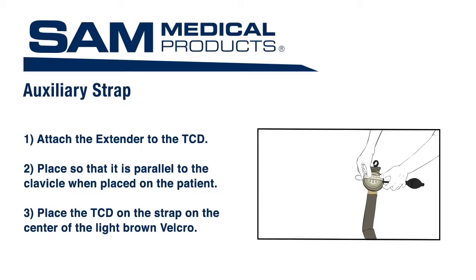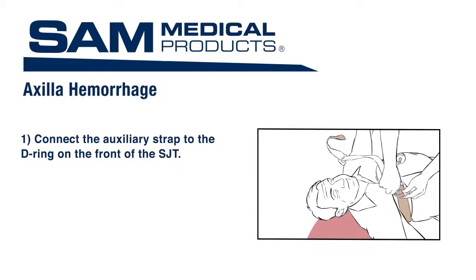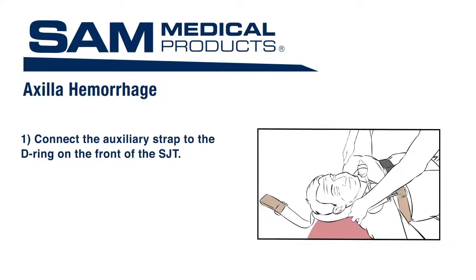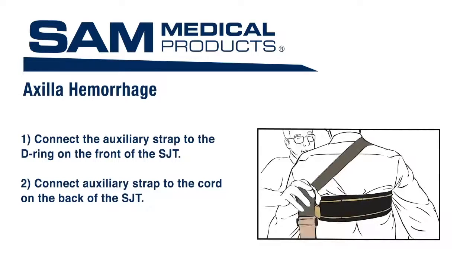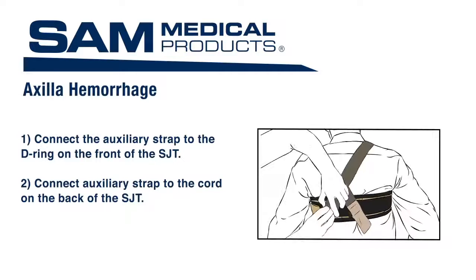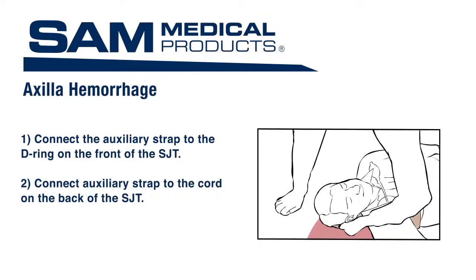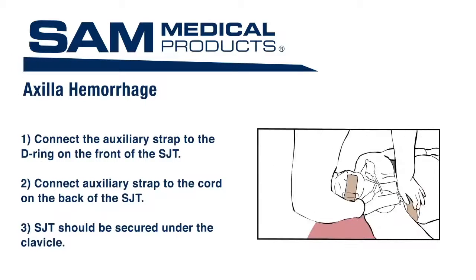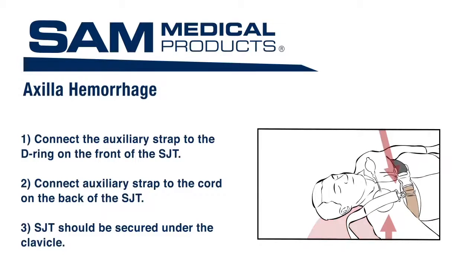The extender should be placed so that it is parallel to the clavicle when placed on the patient and should align with the tube. Then place the TCD on the strap on the center of the light brown Velcro with the tube and hand pump extending out. Connect the auxiliary strap to the D-ring on the front of the SJT using the large clip. Connect the other end of the auxiliary strap to the cord on the back of the SJT using the small clip, as close as possible to the patient's midline. Remove any slack by securely tightening the strap using the brown handle. The TCD with extender should be positioned under the clavicle and adjacent to the shoulder, with the extender parallel to the clavicle.